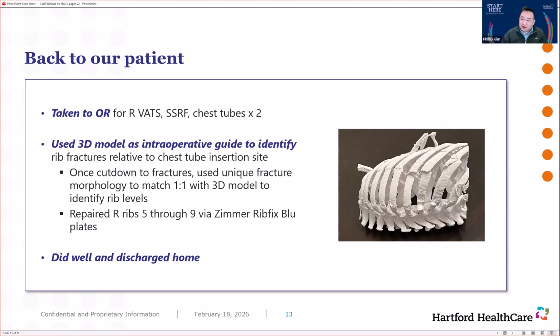Yeah, that's a great thought. And that's certainly technically feasible because there are 3D printed filaments out there that are flexible. So you can print certain segments flexibly and some segments rigidly, so you can have the rib model actually be able to bend and move. That could be an amazing next step to have a more high fidelity reduction of ribs.